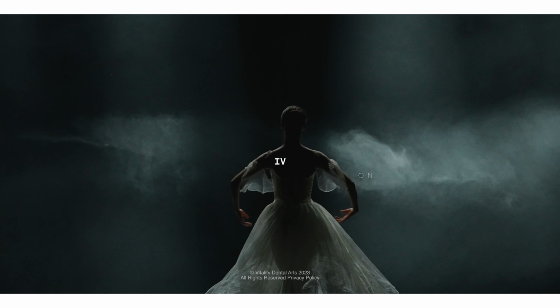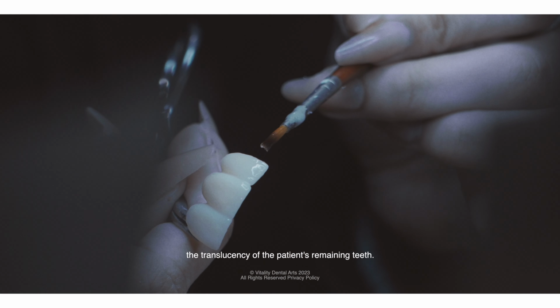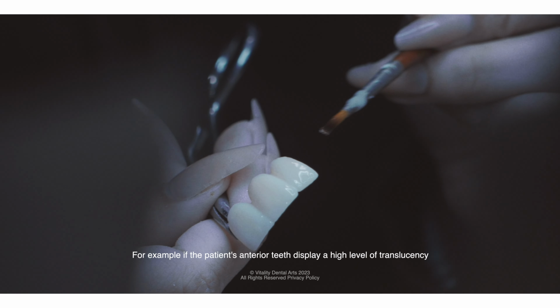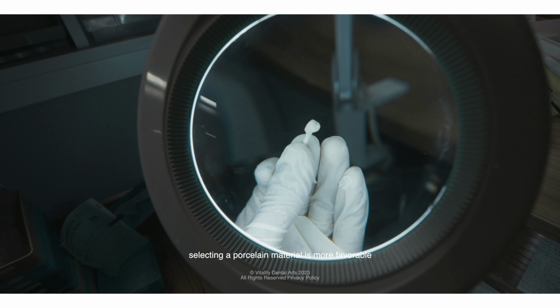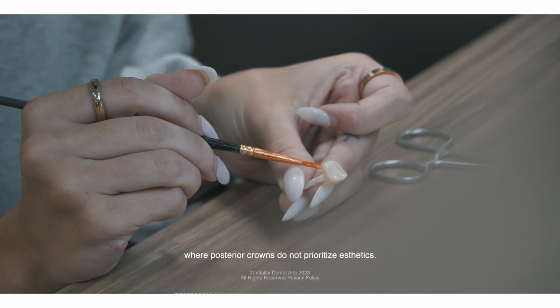4. Selecting the proper material should be based on the translucency of the patient's remaining teeth. For example, if the patient's anterior teeth display a high level of translucency, selecting a porcelain material is more favorable, where posterior crowns do not prioritize aesthetics.